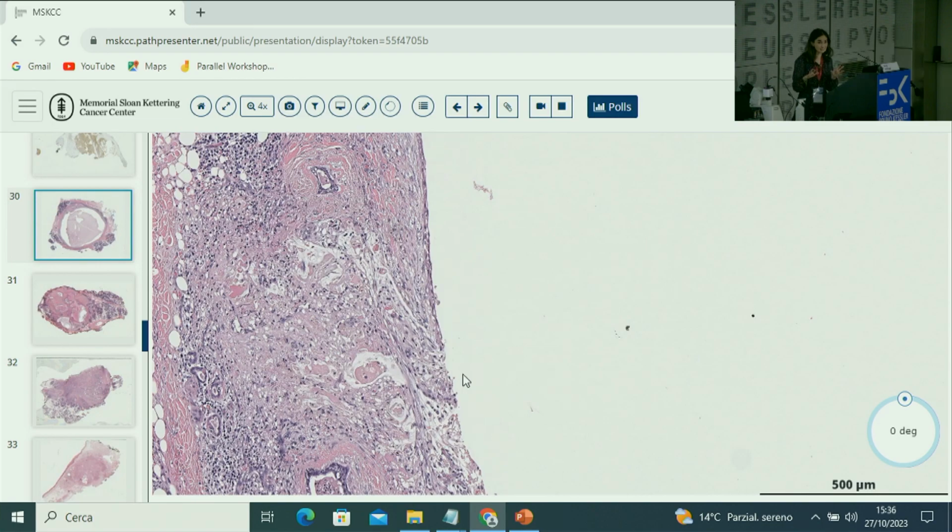When I see cystic mucoep, even if I favor mucoep and I start to see this protrusion, we do the FISH. But even for this, I would do it. The more solid area is consistent with mucoep, so the chance of MAML2 rearrangement is high. Yeah, I think we did it on this one.